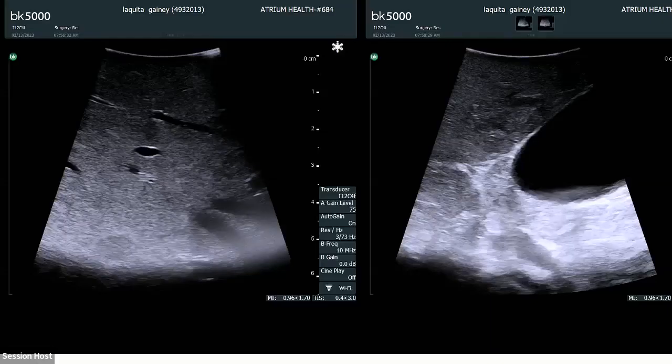So we get to the operating room. I'm looking around at these liver lesions. And so I'm taking a couple of biopsies of the liver lesions. I send a frozen section of that. That comes back as nothing. So those are probably just hepatocellular adenomas.